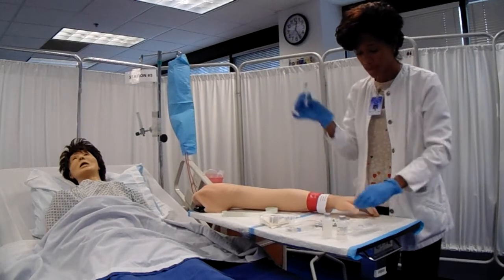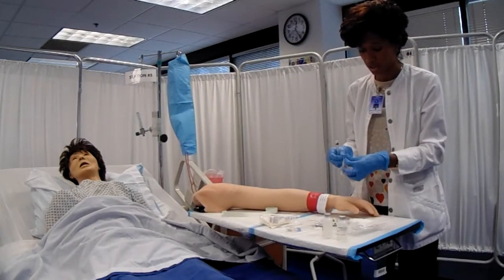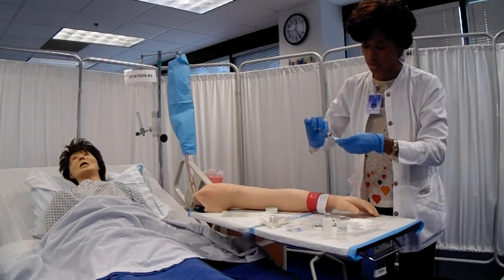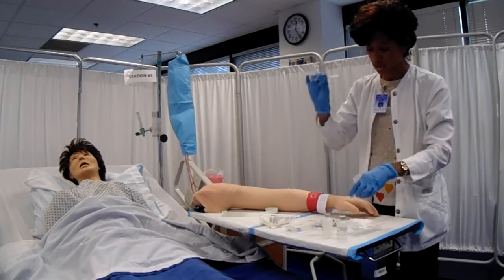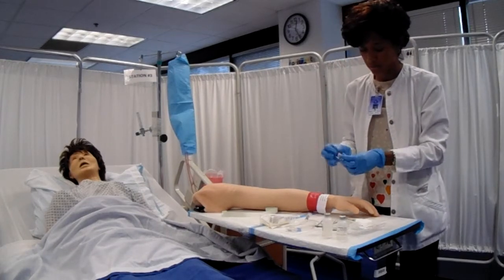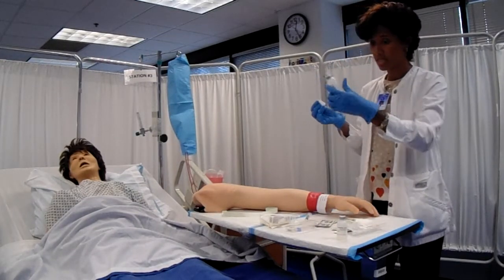I'm using a 3 ml syringe to prepare my flush, and I'm attaching my blunt needle, making sure the hub of the needle remains sterile. I have here normal saline as my flush.